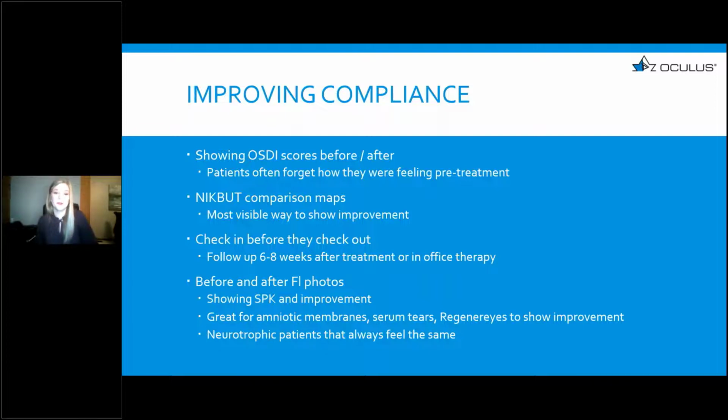And I tell them that if you're not doing better, we're going to change something. It's just not an appointment for me to give you a pat on the back or yell at you for not doing what you should. If I need to change something and pivot, I want to be able to do that at that appointment too. And the before and after fluorescein photos are really wonderful too. I have a couple great examples of that in a couple slides, just showing the SPK improvement.